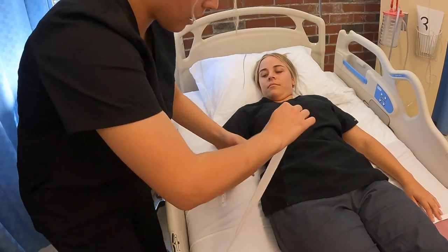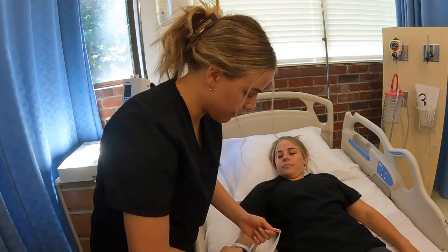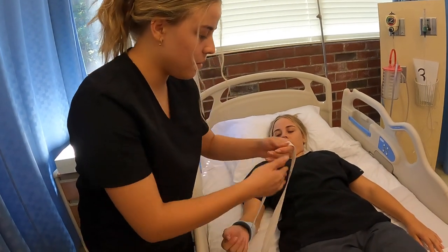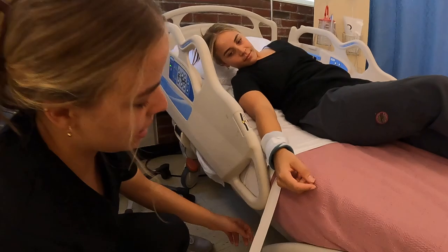When we tighten it up, we want to make sure that two fingers fit between the restraints, because we don't want to cut off circulation to the patient. So now we're gonna go down here to the bed.